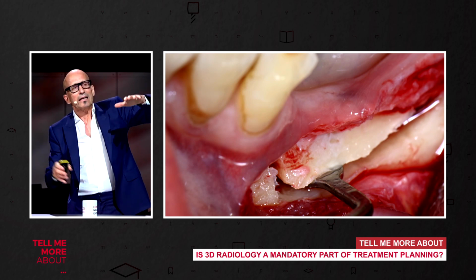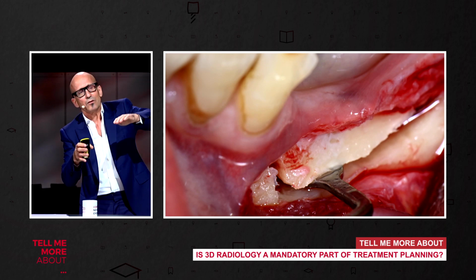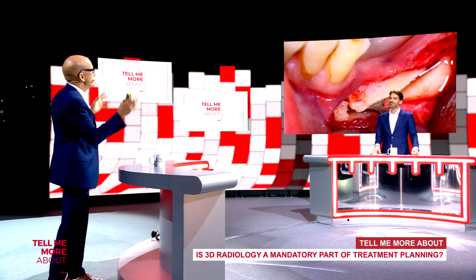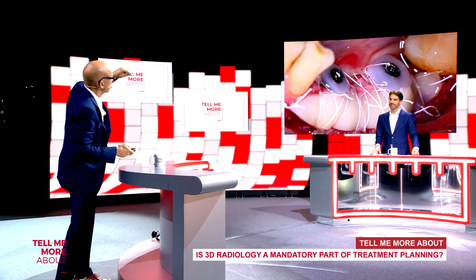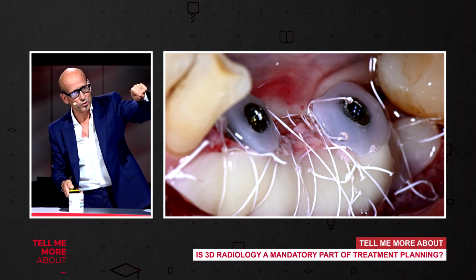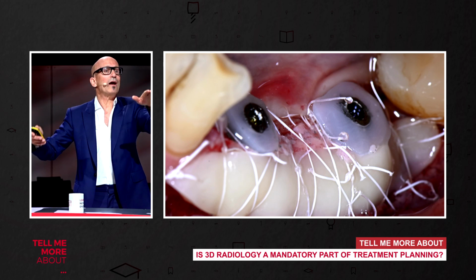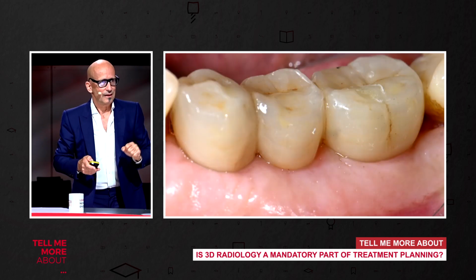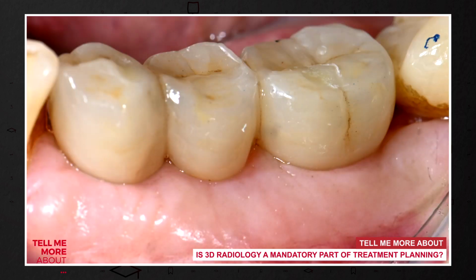Exactly. Then, when you have done, I don't want to go too much in detail. You wait for 3 months, then the bone is there. And this situation is now, after I have 3 months of healing, now I place the implant, I take an impression of the implant, I manage the soft tissue, and now I'm finished. Now I wait 2 months, and this is 2 months later. And the patient gets, after 2 months, in the third session, the final restoration on the implant.